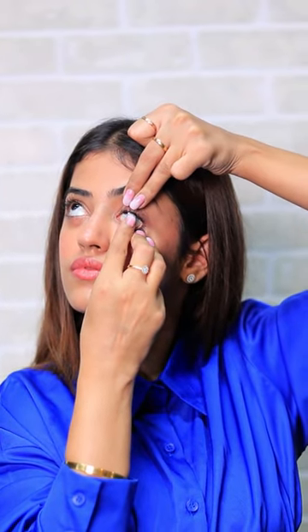Use the middle and ring finger of your non-dominant hand to hold the upper eyelid, and use the middle and ring finger of your dominant hand to hold the lower eyelid. Put the lens directly on the cornea.